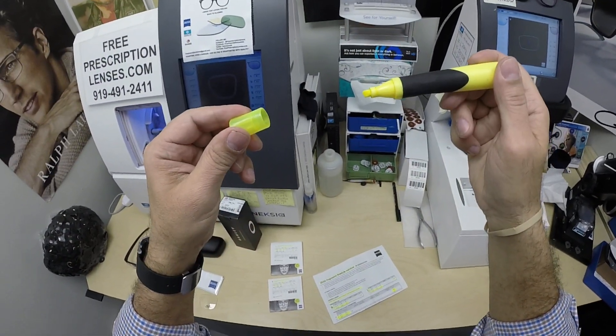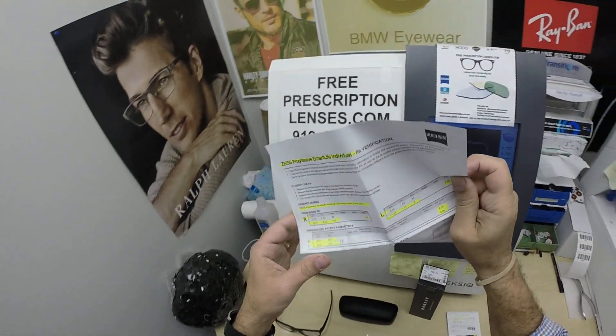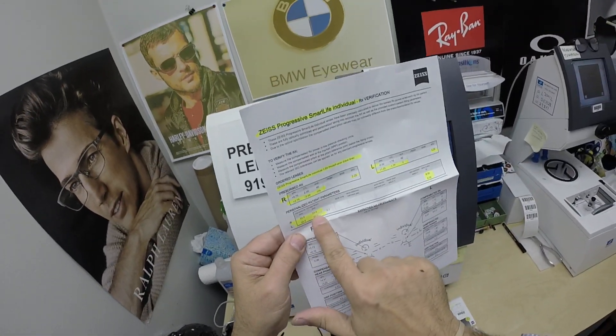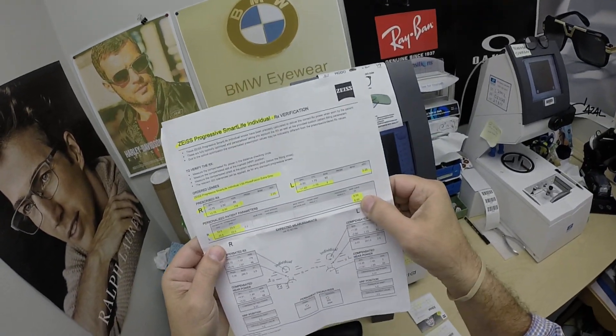And if you guys missed any of that, let me recap. So the pupillary distance for the right and left, the optical center, the segment height, and the base curve of the lens.